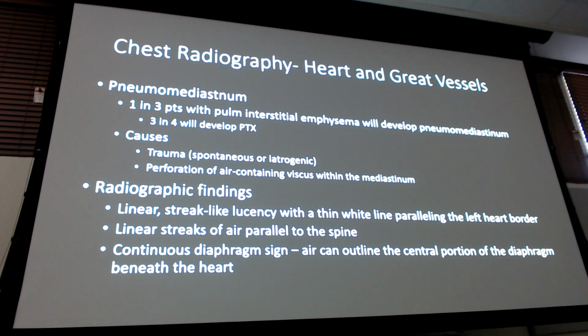Okay. If the pneumothorax and the structures are shifting, we can call it a tension pneumothorax because you're going to treat it, because they're on their way. But make sure you diagnose it clinically. Okay.